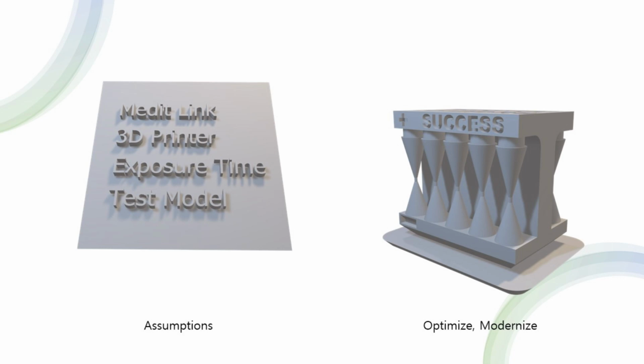The second model illustrates how support structure settings affect the support and output of complex structures. This model highlights the necessity of optimizing support structures to enhance stability and structural integrity during the printing process.